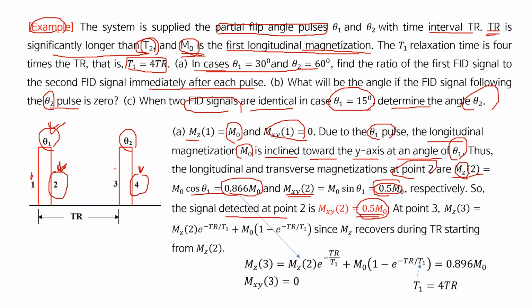Now let's see point 3 here. At point 3, Mz3 is recovering during TR, starting from Mz2. So Mz2 here, starting from here, and recovering during the time TR.